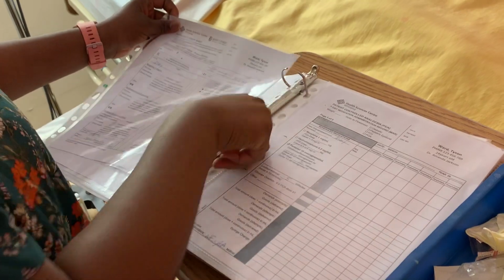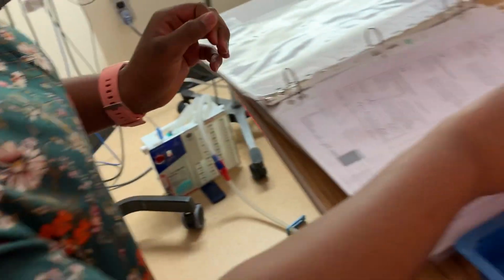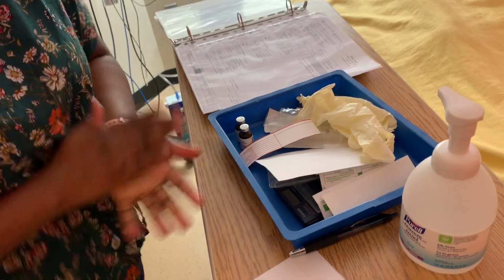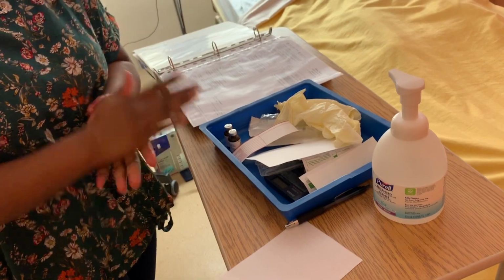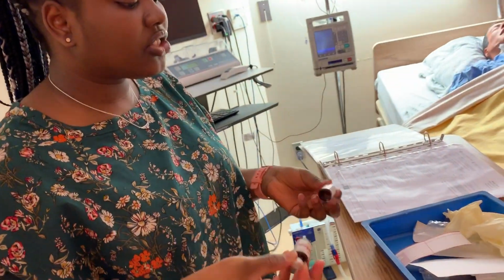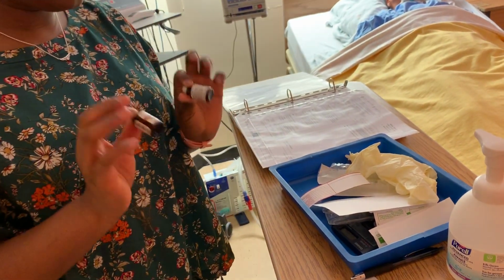So now I'm gonna get my medication. So I'm gonna do hand hygiene now. So I've done my hand hygiene. Okay, so I got my medication from the narcotics counter. I counted it and documented that I'm going to give this medication.